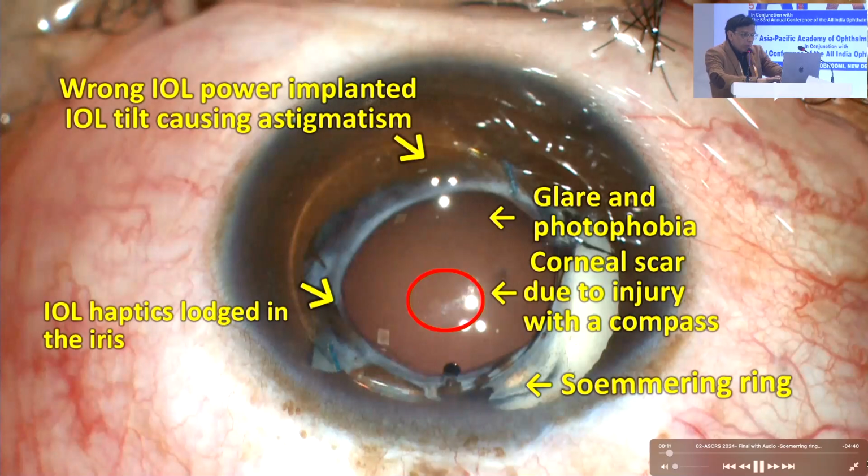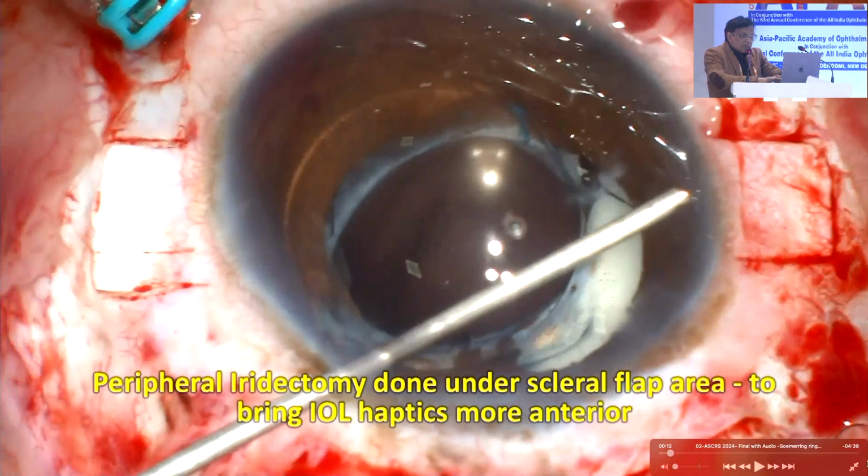Now let's look at this patient here. Somebody had implanted a lens, PC rupture, left the lens behind. Years later, the patient has come to me. The problem was this guy was a big shot in the garment industry. Now what I told him was, you can see the lens is subluxed. Soemmering rings are present. So I told him, no problem, I'll make you all right.